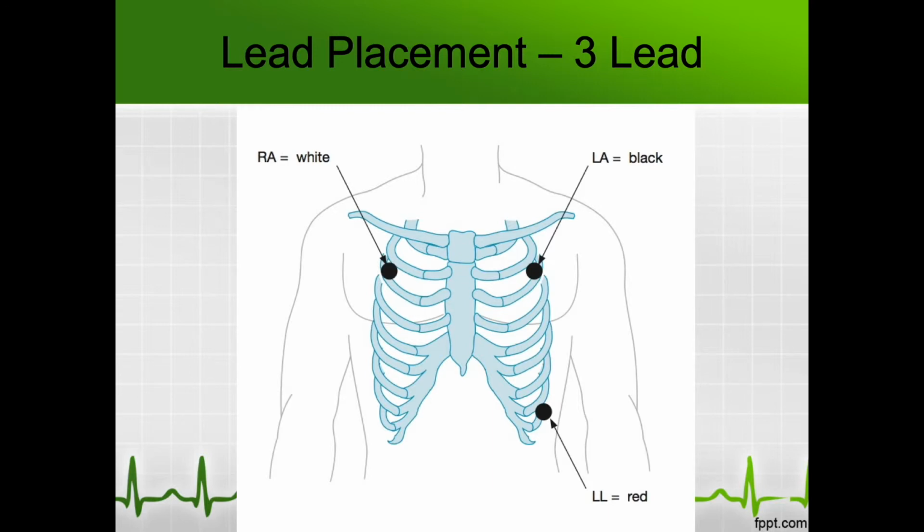Now, sometimes black smoke is seen over red fire, so you have a red lead. Put the red lead directly underneath the black lead for proper placement. This will, by the way, assure that you have your positive and negative leads in the correct order.